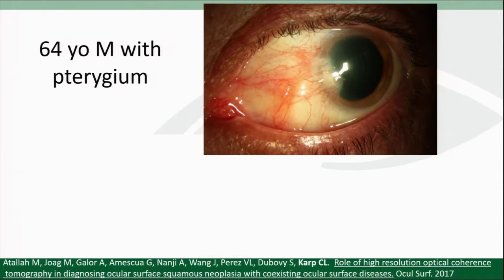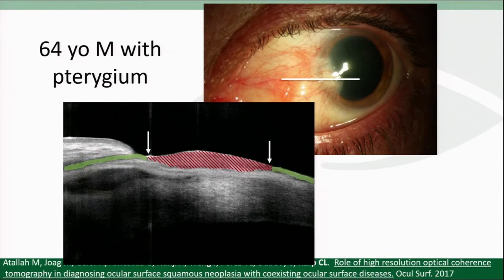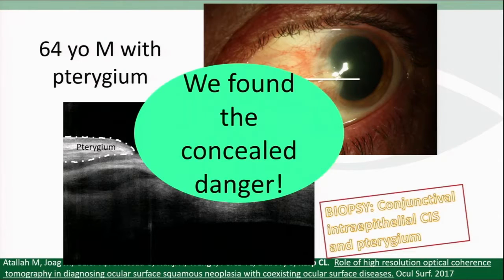Here's another case of a gentleman who came in with a little opalescence on the head of his pterygium, which we frequently see. When I scan him, what we see is normal epithelium that's dark and thin, then thickened hyperreflective epithelium with an abrupt transition on both sides. You also see the pterygium with normal epithelium and stringy hyperreflective tissue. This case confirmed ocular surface squamous neoplasia adjacent to the pterygium.